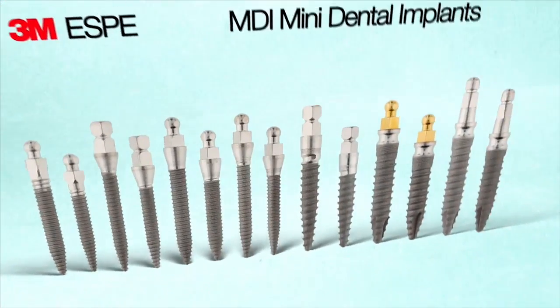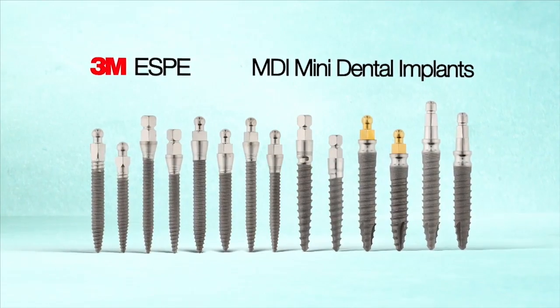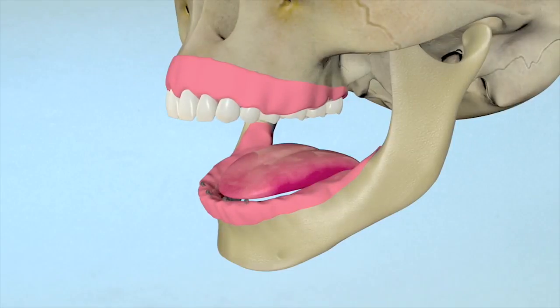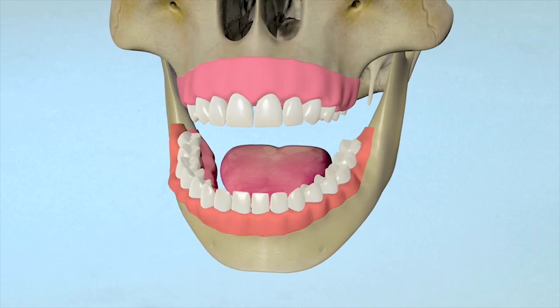MDI Mini Dental Implants from 3M ESPE are designed to provide secure long-term stabilization of full or partial dentures and fixation of bridges. This program demonstrates the procedure for placing implants in the mandible to stabilize a lower denture.